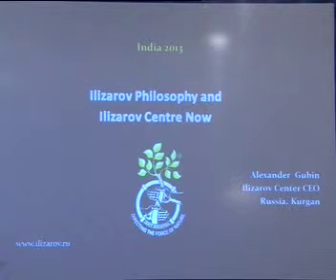For me, and I hope for you in the future, the most important thing is that when you have the Ilizarov method in your hands, you are first of all safe, and second, you are free. Because if you know how to work with Ilizarov frames, if you know the principles, the main ideas, you will be free in every other field of orthopedics and traumatology.